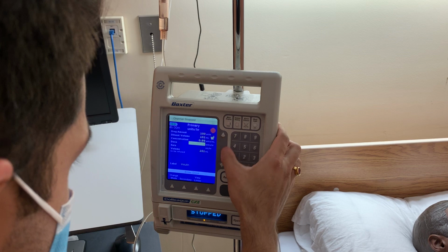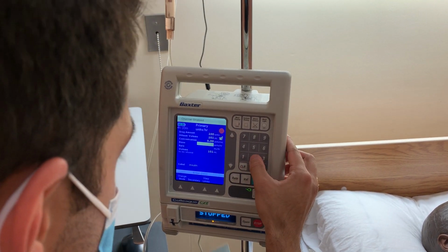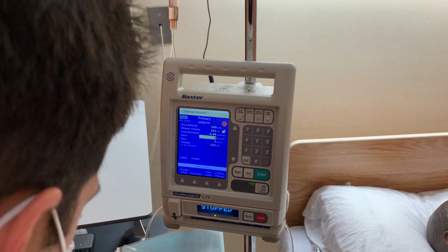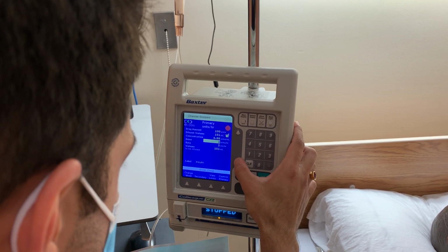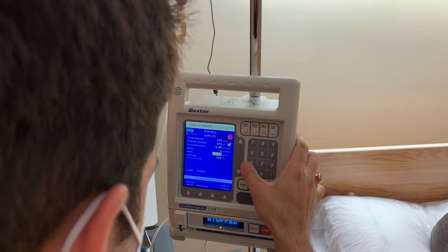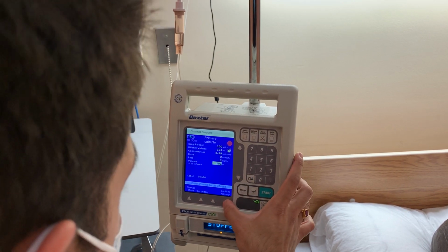Perfect. Okay. And the dosage I'm going to be running it at is going to be 2 units per hour, which is going to be equivalent to 2 mLs an hour. 2 units per hour. And once I've confirmed everything, volume to be infused is 101 mLs, I'm going to be confirming primary.